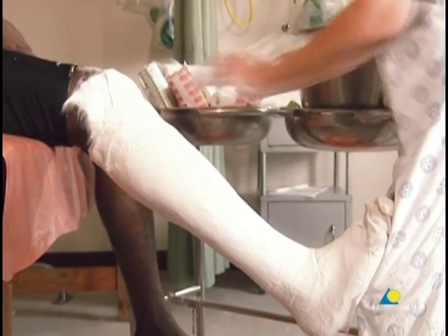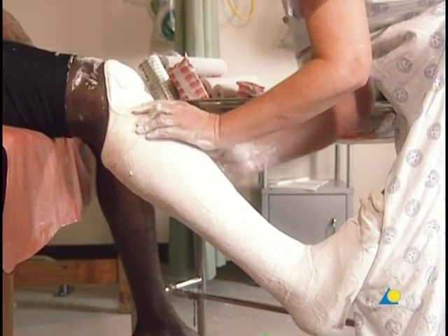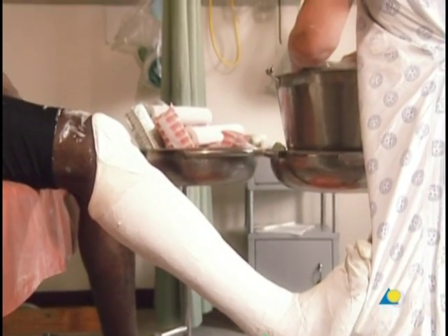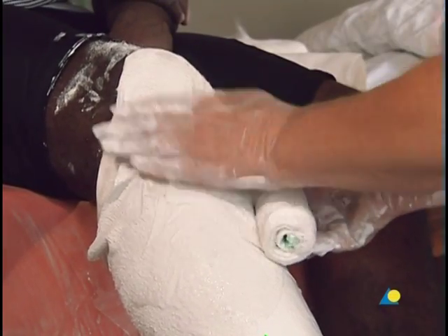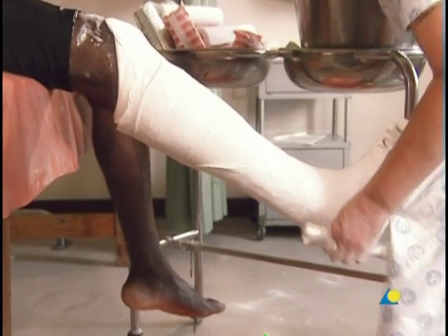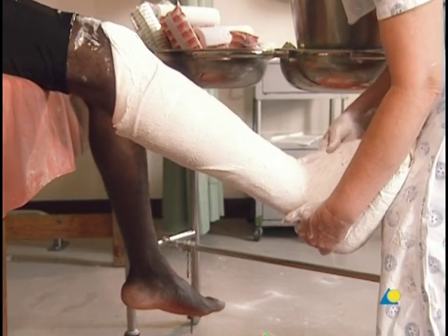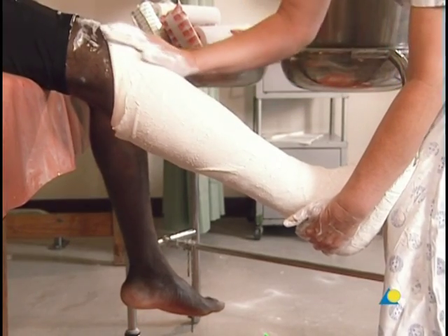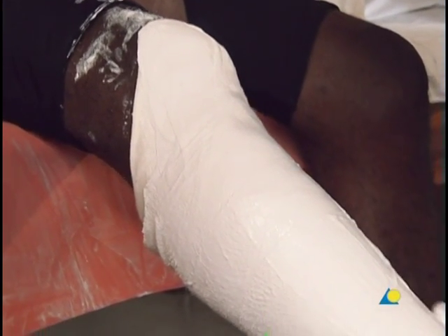The stockinette is folded over the proximal edge of the cast. A third plaster bandage is applied in the same manner as the second; it secures the loose end of the stockinette. The plaster is molded to the curve of the tibia, the malleoli, and Achilles tendon. The result will be a secure fitting cast.